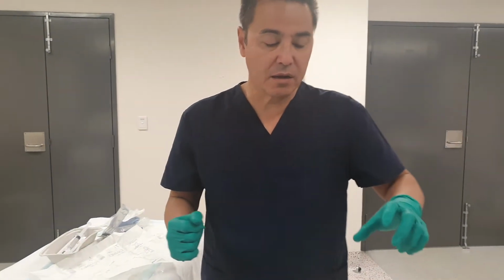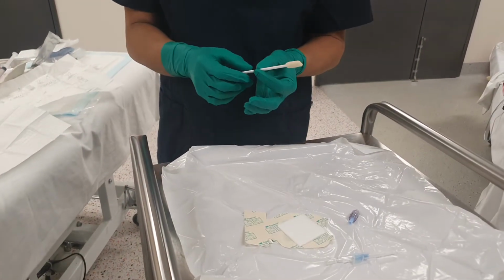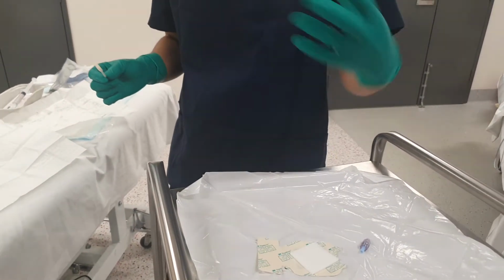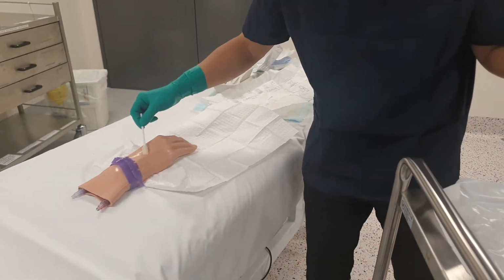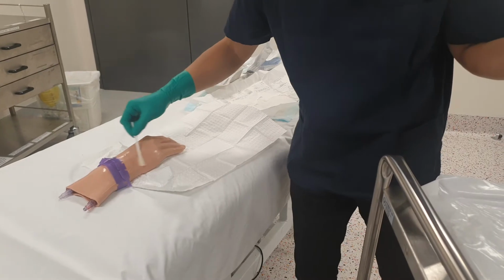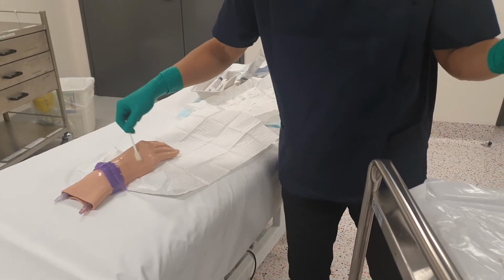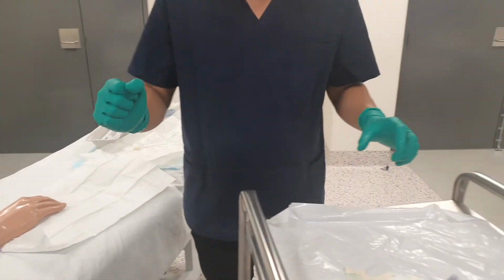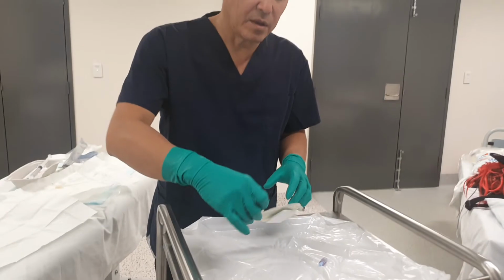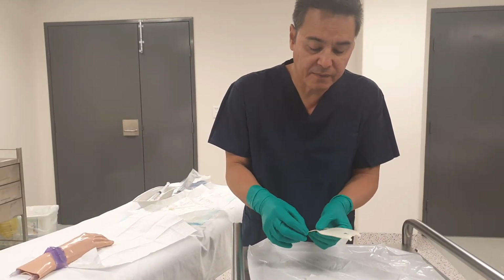Okay, so then I'll start off the procedure with cleaning the area. My tourniquet is already on, okay. So now I've got my clean area and my dirty area. So I'm going to start from the center of where I want to put this cannula in. And I'm going to let that chlorhexidine alcohol solution do its job. While I'm waiting, I'll get my occlusive dressing ready.